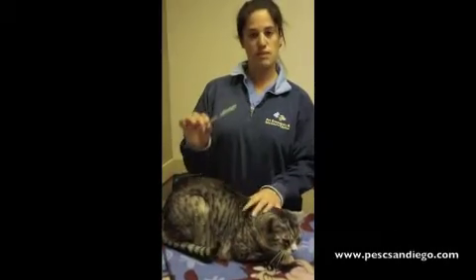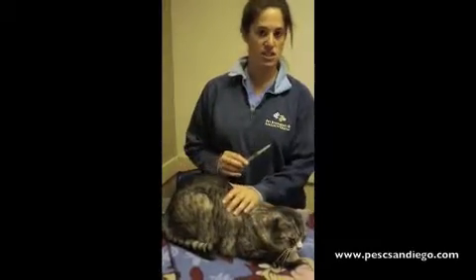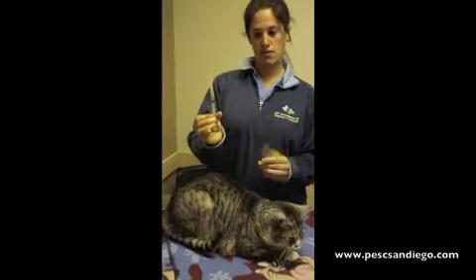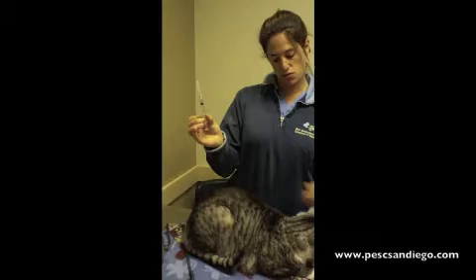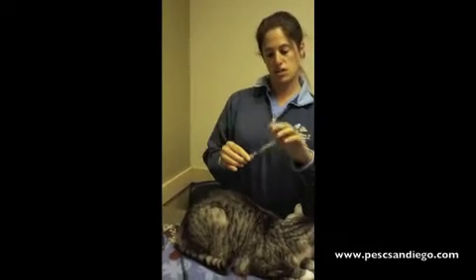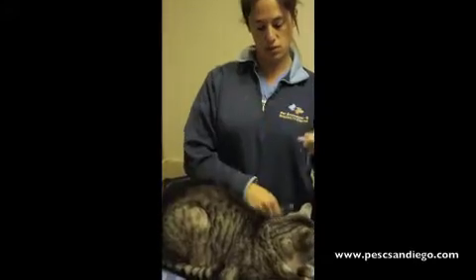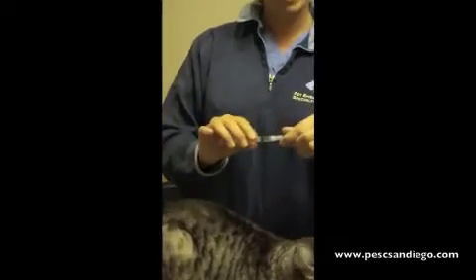Subcutaneous injections can be administered at home to provide the patient with any medication necessary. Generally you have a volume drawn up into your syringe. You want to replace your needle, removing the needle and replacing it with a fresh one — nicer for the patient.